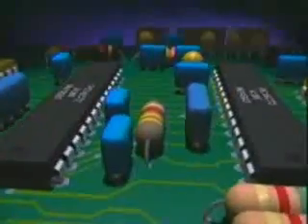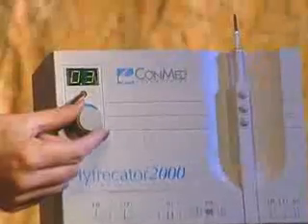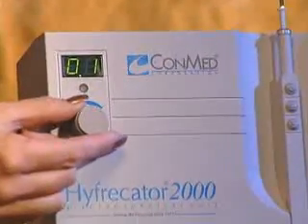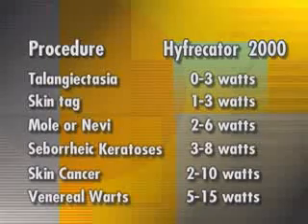The Hyfercator 2000 presents significant advances in precise energy delivery at low power settings — the effects it delivers at very low power settings are the most precise for a device of its type. Because the Hyfercator 2000 is so precise, it may require slight power adjustments at low power settings to optimize the clinical effect. A suggested power setting chart has been included with your Hyfercator 2000 to assist you in achieving the very best clinical results. Now you're ready to begin.